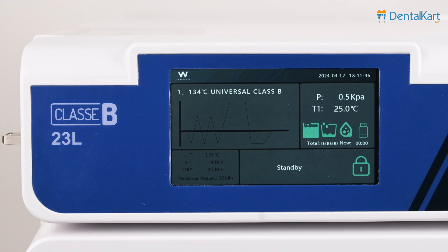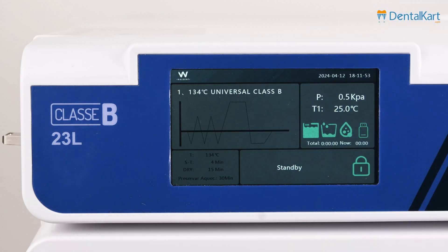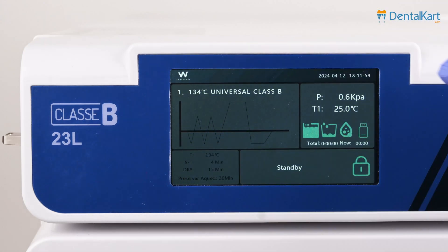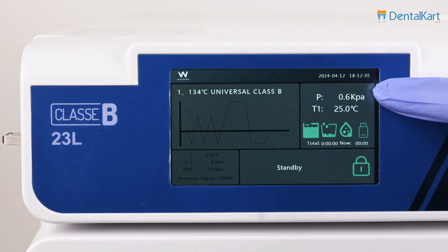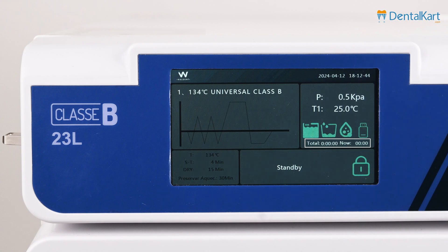On the display screen, we can see the sterilization cycle name, the Walden brand logo, the working diagram, working status, sterilization pressure, temperature, date, total time, and the time of the current step.